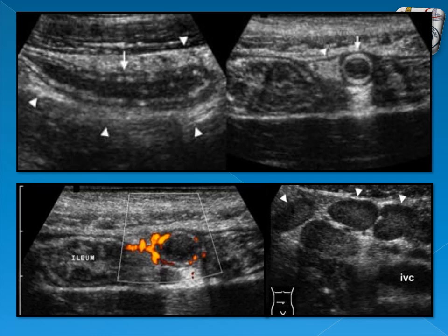Another example: this is the thickened wall of the appendix shown in longitudinal section and transverse section. It is also thickened and hypervascularized. There are multiple related lymph nodes and a minimum amount of fluid present.